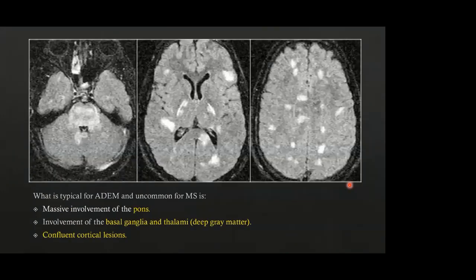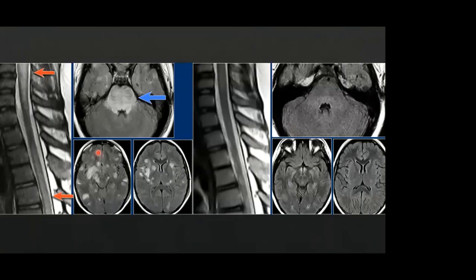The brain lesions in ADEM are distinct from MS. ADEM can show massive involvement of the brainstem, particularly the pons, which is not usually seen in MS. Involvement of deep gray matter — basal ganglia and thalami — is common in ADEM and uncommon in MS. Large confluent cortical lesions may be seen in ADEM, versus smaller juxtacortical lesions in MS. A patient with ADEM is shown with massive pons involvement, right-sided basal ganglia and thalami involvement, confluent cortical-based lesions, long-segment cervical-thoracic cord involvement, and follow-up after four weeks showed interval resolution.